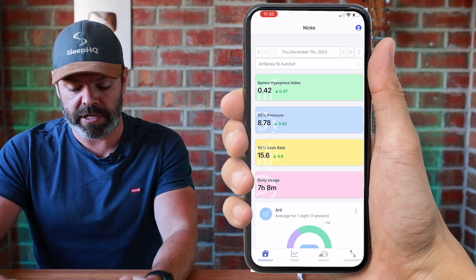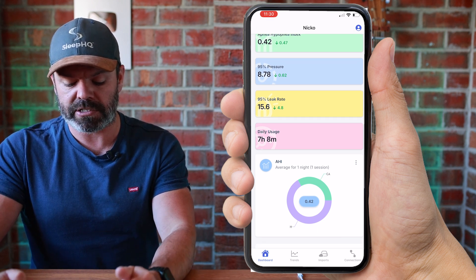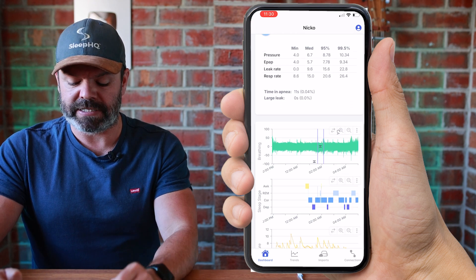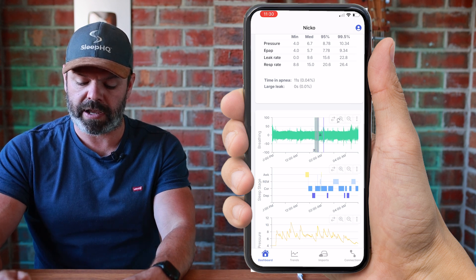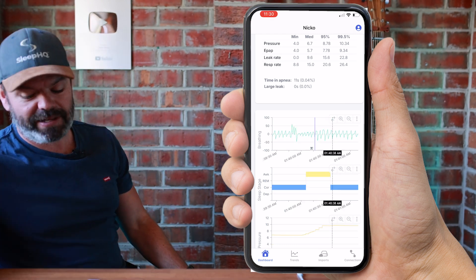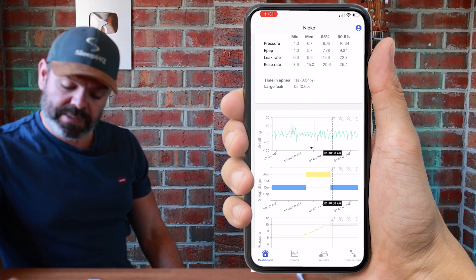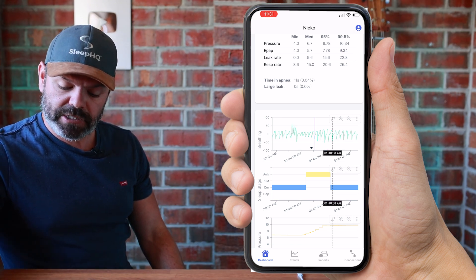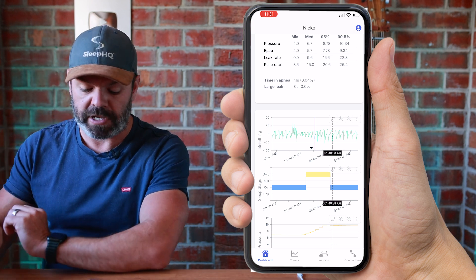Now we can come across to the dashboard and check out all the data. Here it is - we've got some summary data up the top: the apnea-hypopnea index, daily usage, and so on. But if you scroll down we get some highly detailed data. Here's the breathing - we can see two hypopnea flags here. I can just click and drag to zoom in, and we can see right here - how cool is this! We've got our breathing, and you can see a hypopnea flag, this little purple vertical line with the 'H'. The hypopnea is changing the breathing, and you can also see that it woke the user up out of sleep.